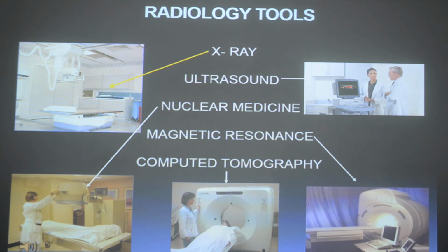In an ER setting, you need to differentiate what type of stroke it is. Is it a hemorrhagic stroke or is it an infarct? Because the treatment is different in both. In an infarct, you would anticoagulate. In a hemorrhagic stroke, you would not give anticoagulant. So this is rapidly determined when you ask for a CT through an ER. It is done within 5 or 10 seconds, and then you can plan accordingly.